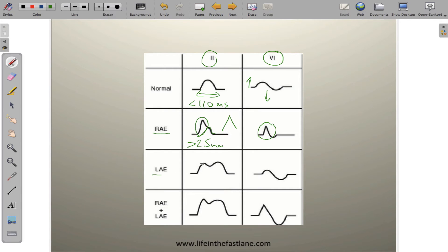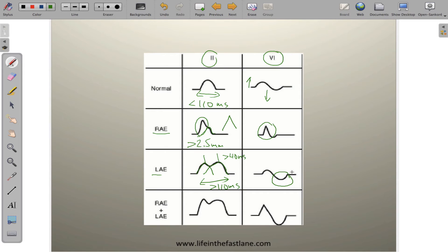In left atrial enlargement, the right atrium depolarizes first, followed shortly thereafter by the left. The peak-to-peak difference is greater than 40 milliseconds — this is P-mitral. It looks like an M-shape and is a wide, prolonged P-wave greater than 110 milliseconds. In lead V1, the terminal portion of the biphasic wave exceeds 1 millimeter in depth. If you combine both, you get biatrial enlargement — an increase in both amplitude and duration due to the respective contributions of right and left atrial enlargement.